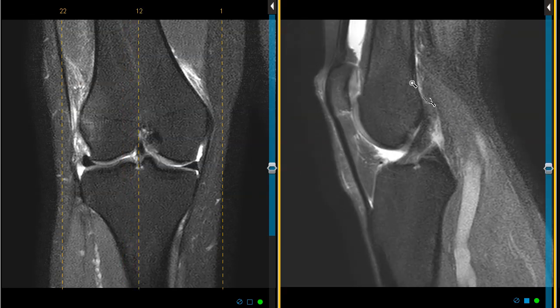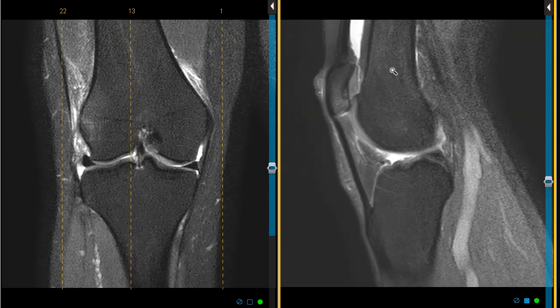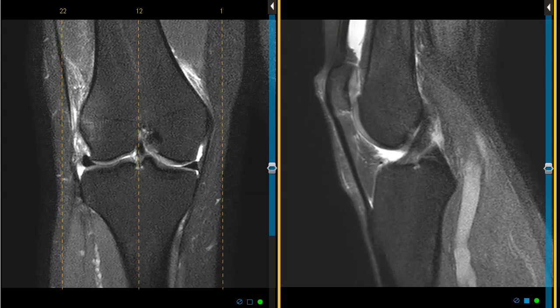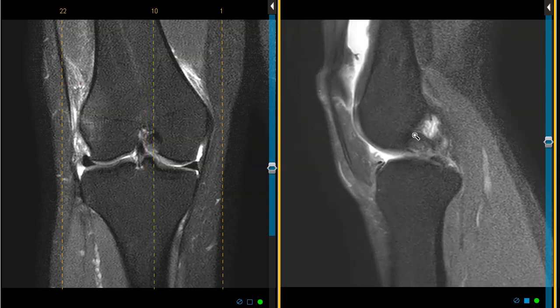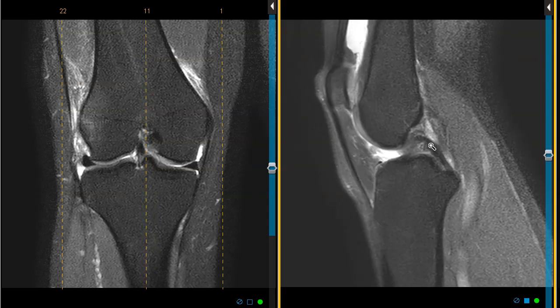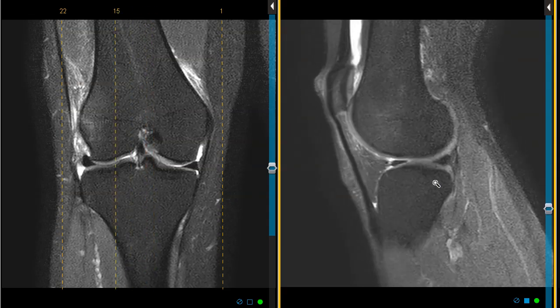This is a sagittal view. Her femur is here, her tibia is here. She had a pop, so we worry about the ACL, but her ACL looks pristine. This is her anterior cruciate ligament, ACL, coming from the femur to the tibia. Her PCL is this dark band here, looking normal, so no ACL tear.